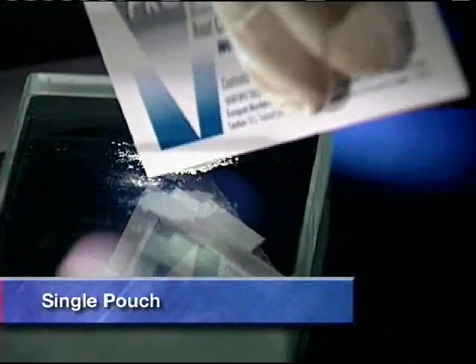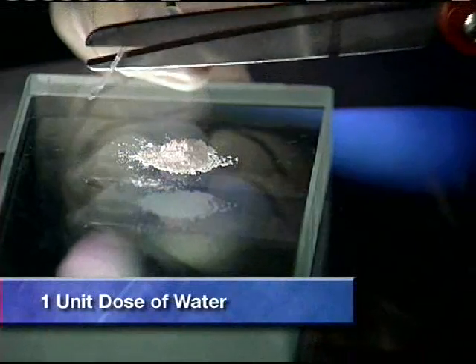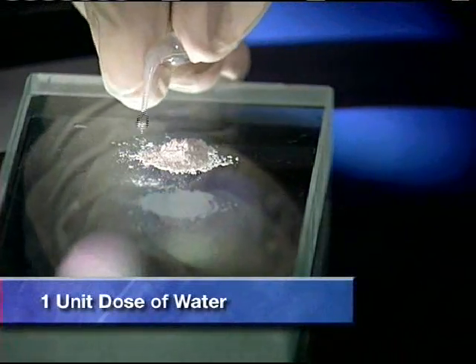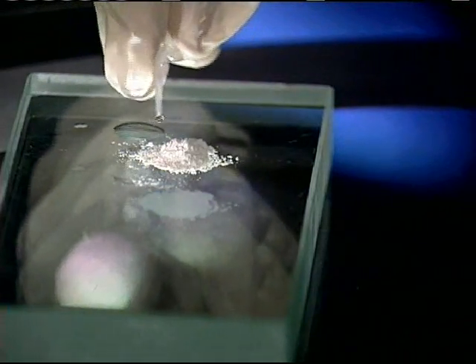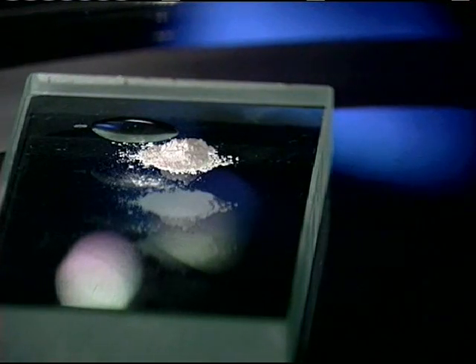First, open a single pouch of ProRoot MTA and dispense the entire contents onto a mixing pad. Next, cut off the end of a ProRoot MTA unit dose of water and squeeze out the entire contents onto the mixing pad next to the dry ProRoot MTA material.